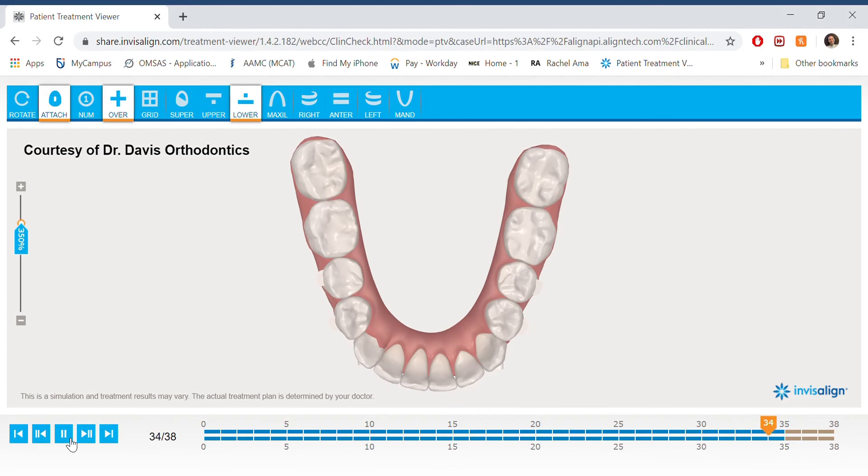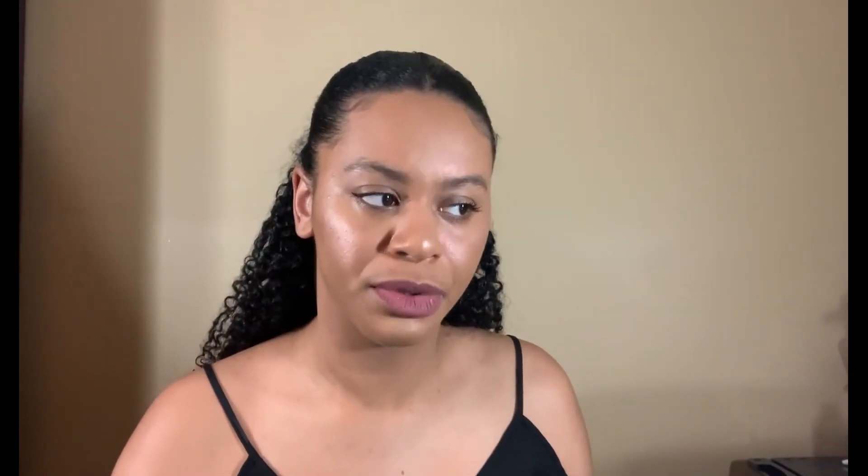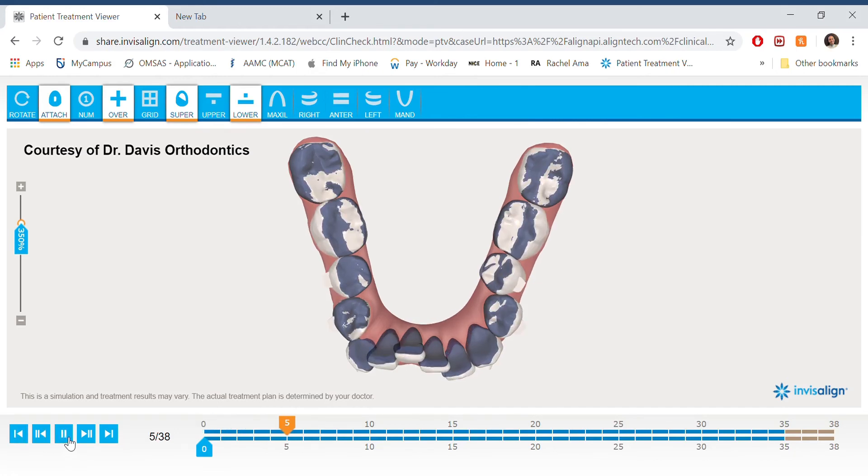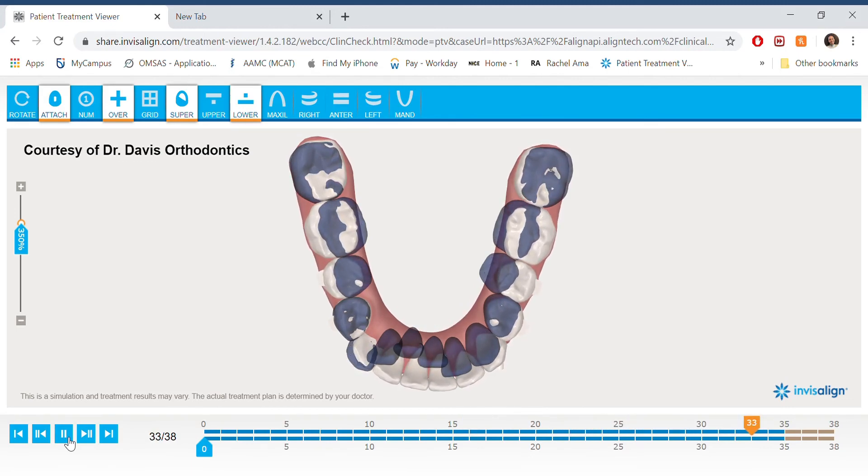There are a few other options I didn't show, like the grid and the super. The grid is pretty straightforward — it just shows a grid over the regular animation. Super is for superimposed, which is actually pretty cool. It lets you see both the initial and final positioning at once, with the initial being a sort of shadow that stays in the same spot as you flip through. It's a little hard to visualize when there are teeth overlapping though, so it wasn't really my favorite feature.